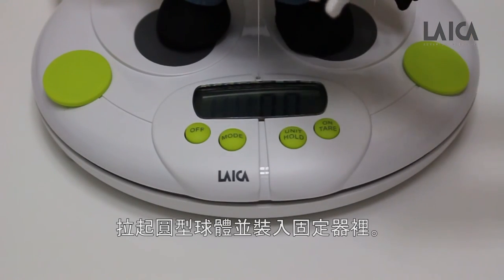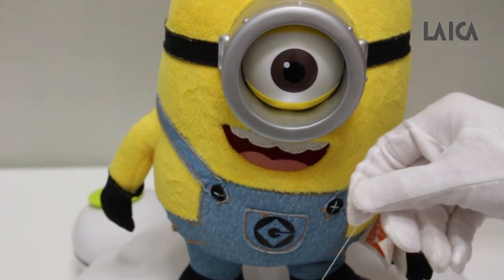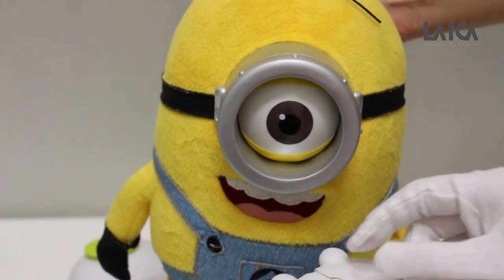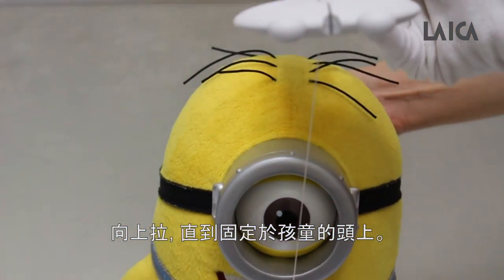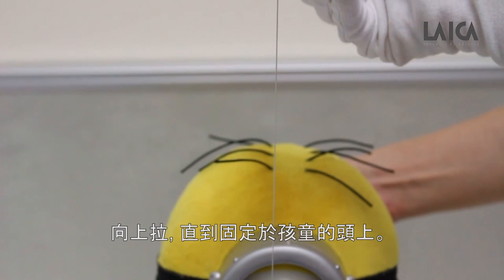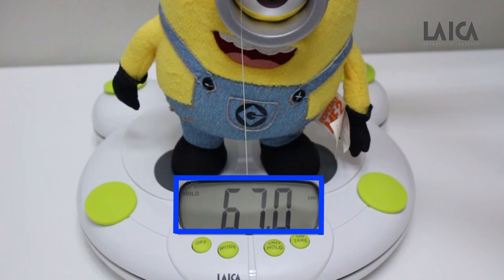Pull up the knob and insert it into the height-fixing accessory. Pull it upwards until it is positioned on the head of the child. If this video has helped you to operate the LAICA electronic baby scales, you're welcome.